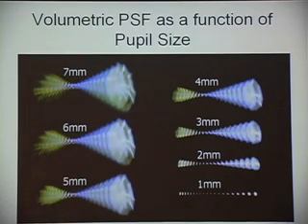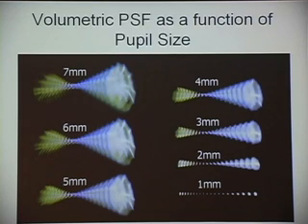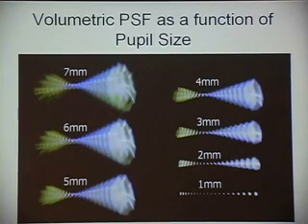Are you able to compute that from one measurement, or do you actually? From one measurement. So you don't actually have them change pupil size by changing ambient light? You measure them at the max. You measure them in a dark room. And because you're able to tell which part of the system the aberrations are associated with, you can figure out how it's going to change as the pupil size constricts down. There's no other geometric effect with change in pupil size, or it's minor? There are very small effects, and that's something that probably would be worth including. I didn't, but it's a good question.